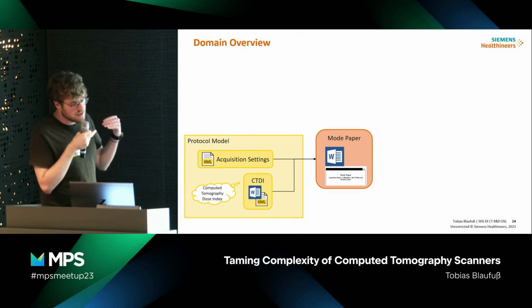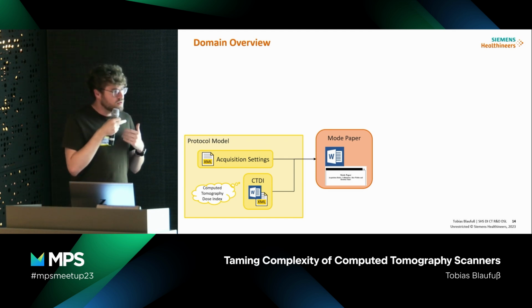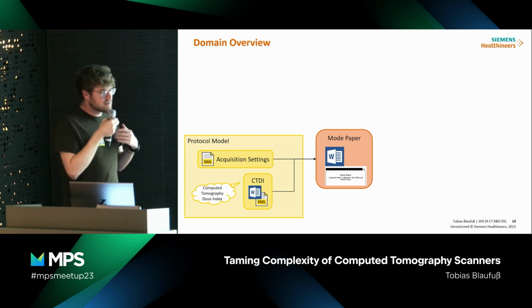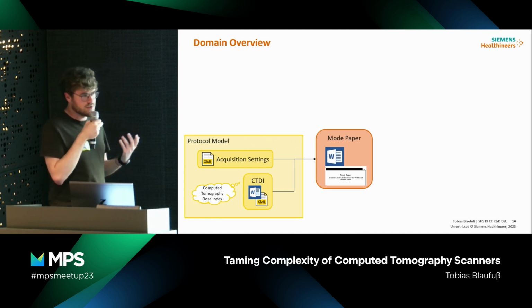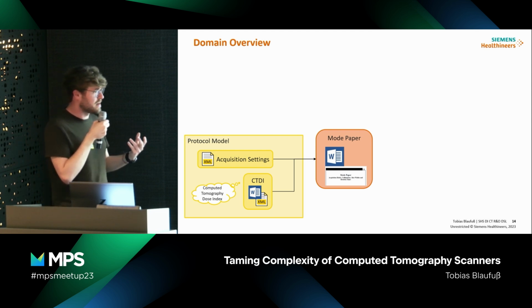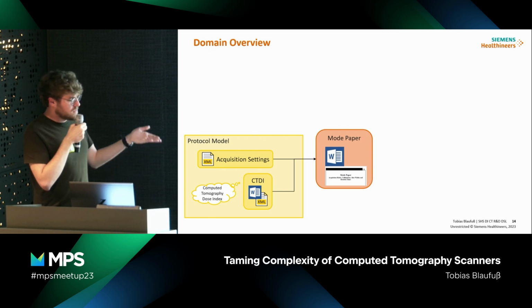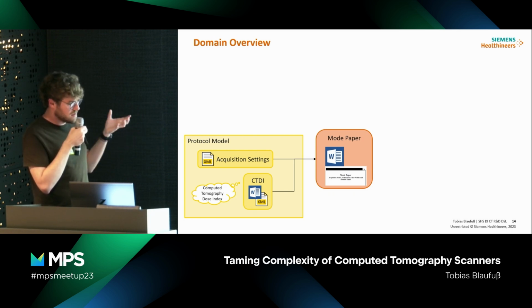It has to be documented what we do on a long-term basis, because otherwise we can't release a scanner in certain areas. For example, the FDA in America, they require us to do this kind of documentation, so we can't cut out Word or these specifications completely.